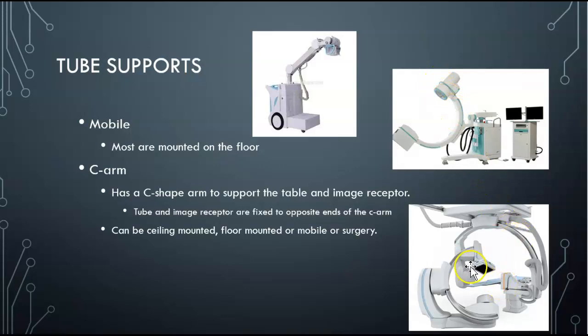So this right here is a dual floor mount. So we have floor and ceiling mount. So we have two C-arm units that can work simultaneously to help reduce dose and contrast for patients, as we can see AP and lateral at the same time. It's pretty cool. Really fun to drive. Boy, you have to be on your toes.